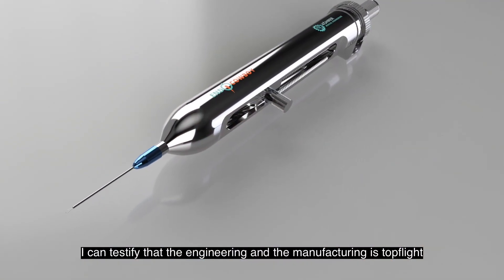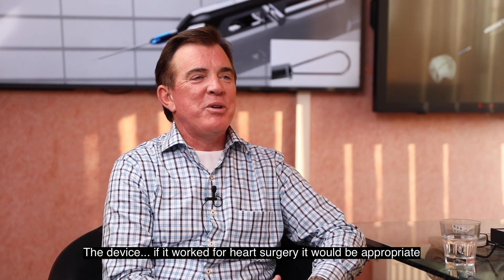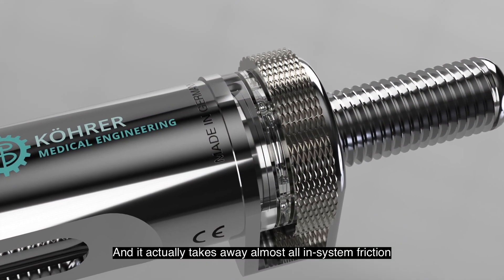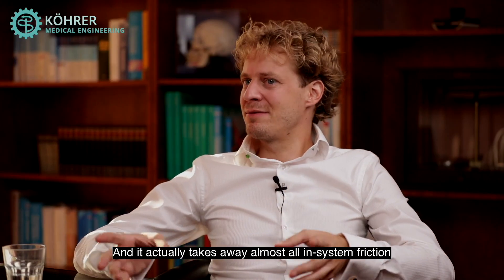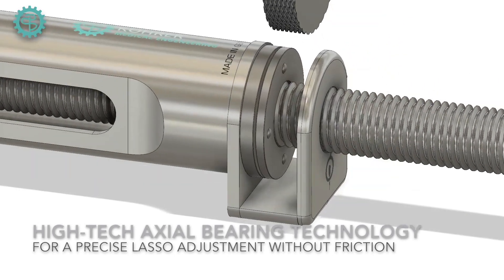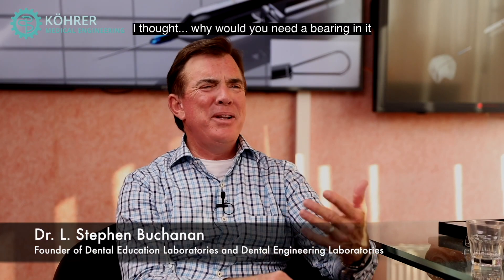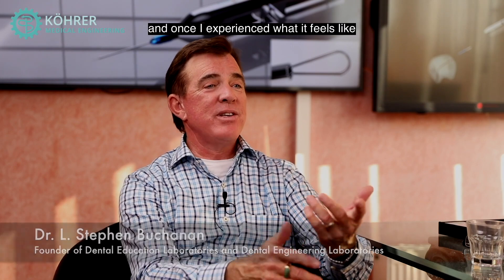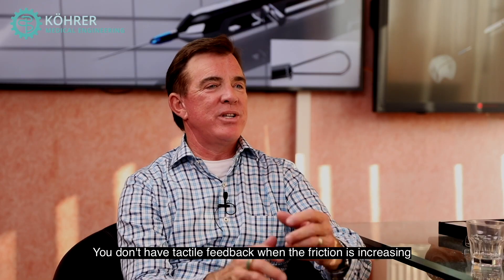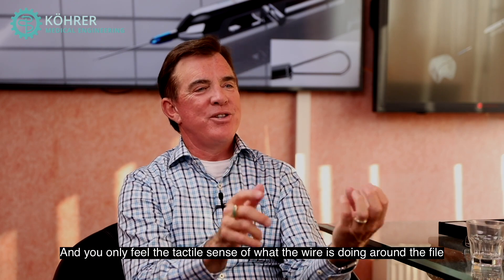I can testify that the engineering and manufacturing is top flight. The device — if it worked for heart surgery it would be appropriate. It's made to that level. We put an actual bearing in it and it takes away almost all in-system friction so that you can really feel the tension of the loop. When you first showed me this and we talked about the bearing, I thought, why do you need a bearing there? But once I experienced it, without it you have no control — you can't feel the tactile feedback when the friction is increasing.